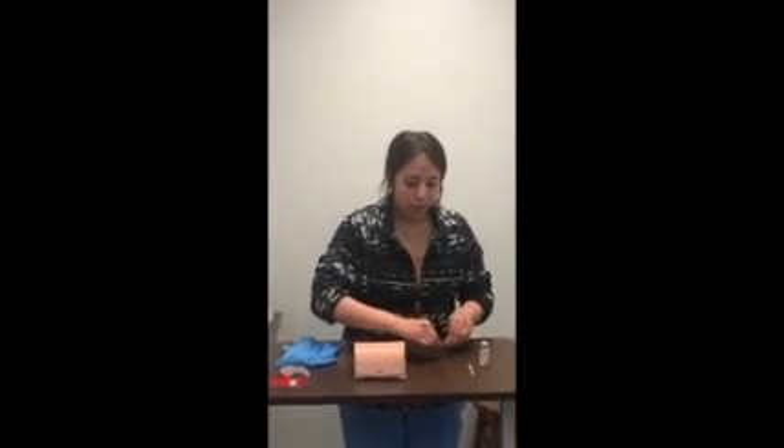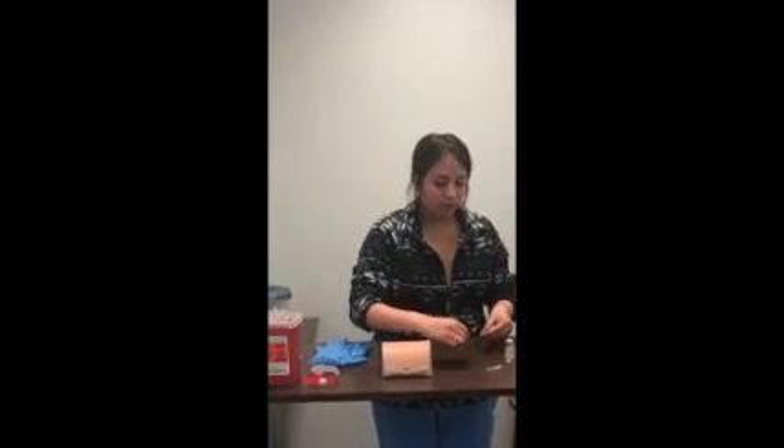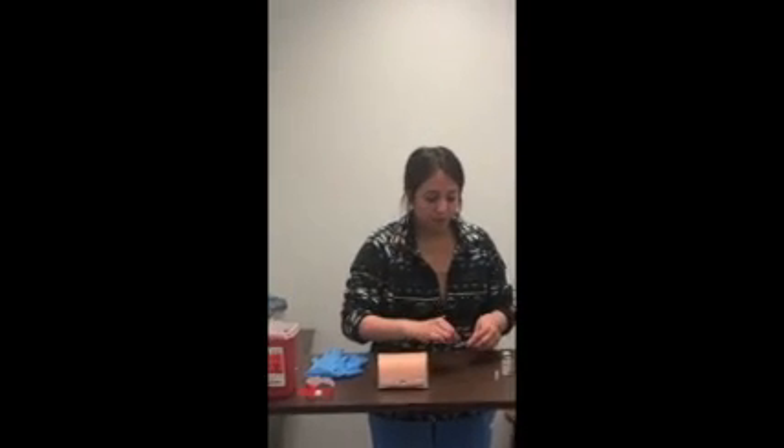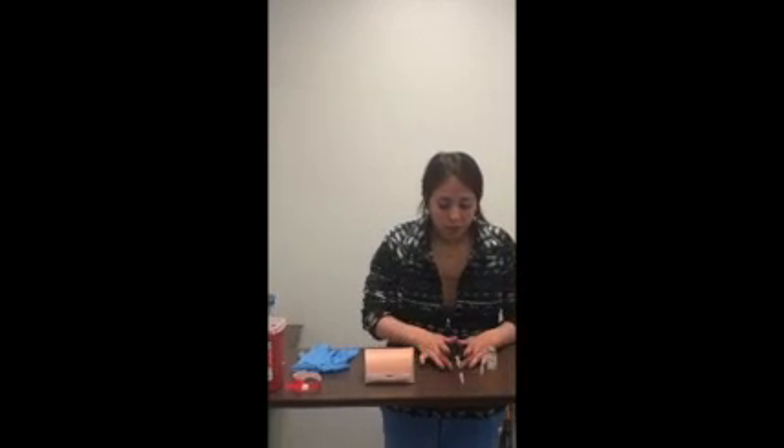After that, I will change out my needle, using the 25-gauge. I will then correctly label my medication and take it to the patient's bedside safely.